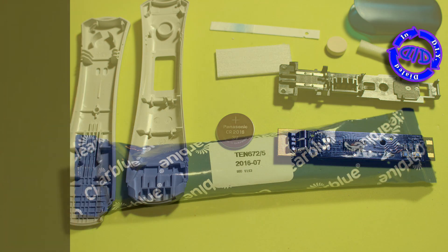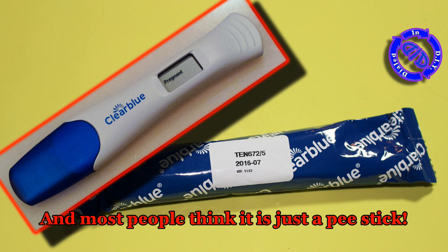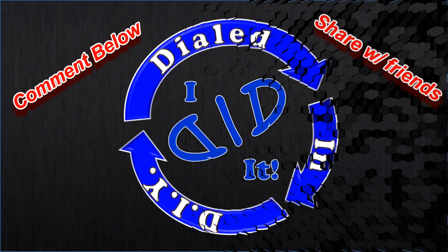As I'm sure you've seen, this little test that we might have thought was pretty simple actually is much more complicated. And to think, most people think it's just a pee stick. The picture above is an actual complete positive test result, but the one taken apart in this video was a clean unused test.